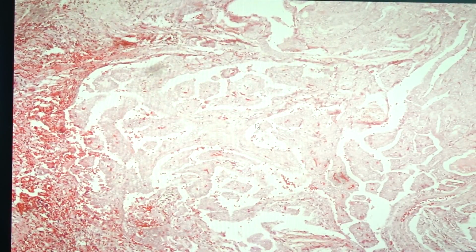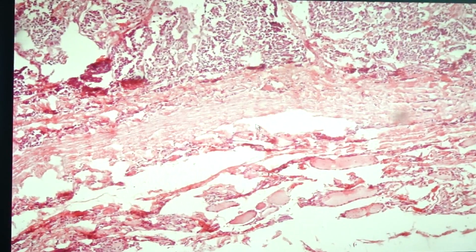Remember the spelling of psammoma body: P-S-A double M-O double M-A. Okay, am I correct? You just check. Okay, so next we have medullary carcinoma, which is slide 178.